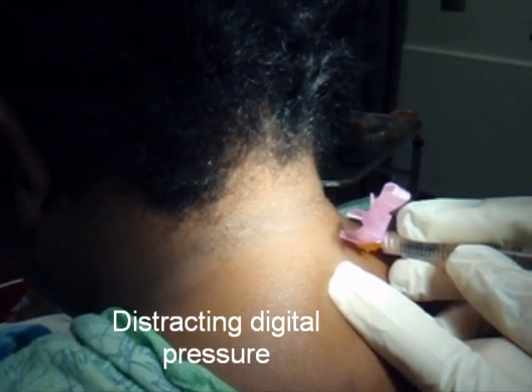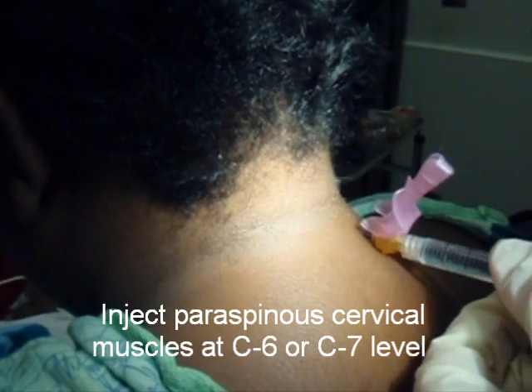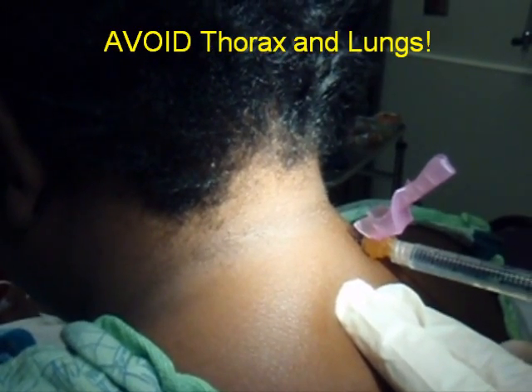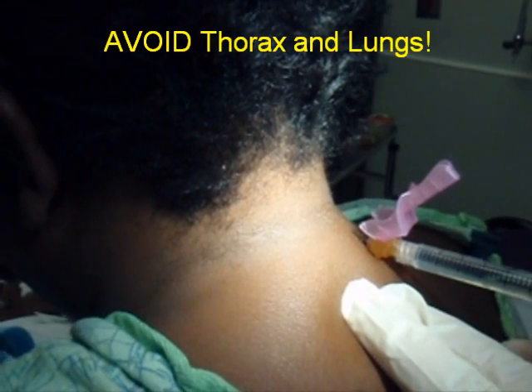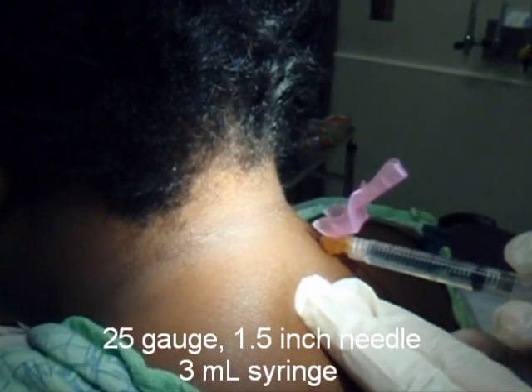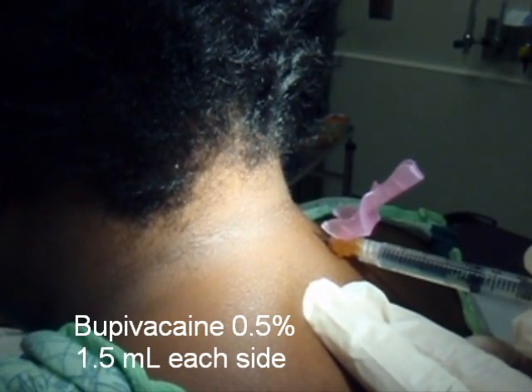I'm going to go into this area parallel with the bed and put that inch and a half needle, 25 gauge, all the way in, aspirate back, make sure you don't get any blood, and then you just inject slowly — relatively slowly — 1.5 ml.